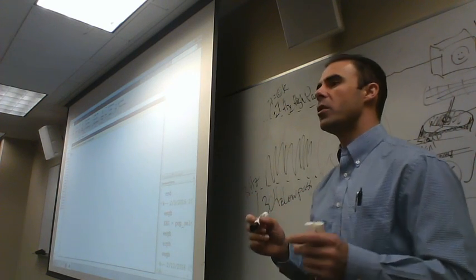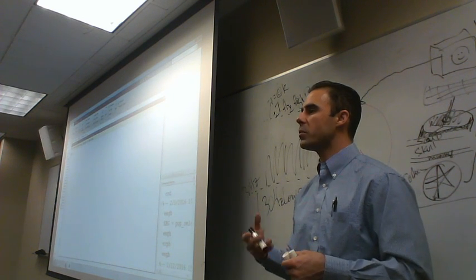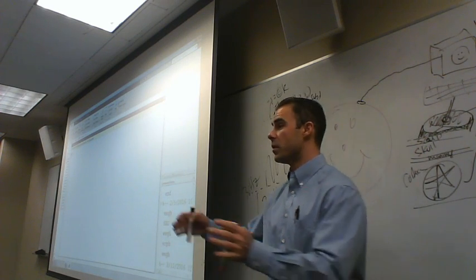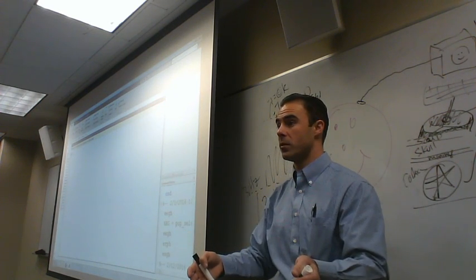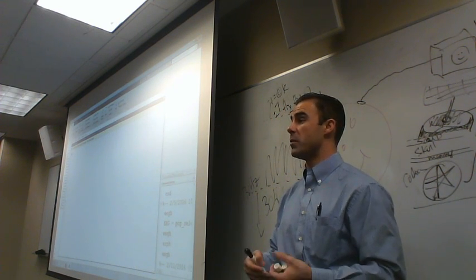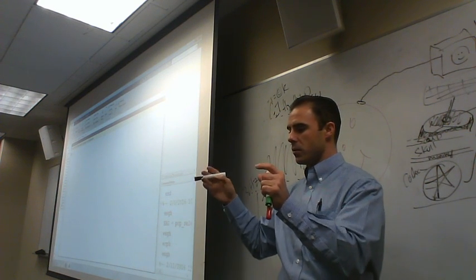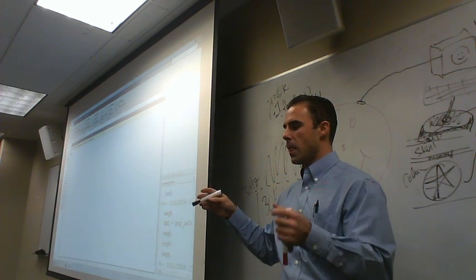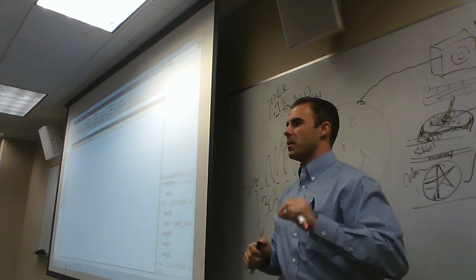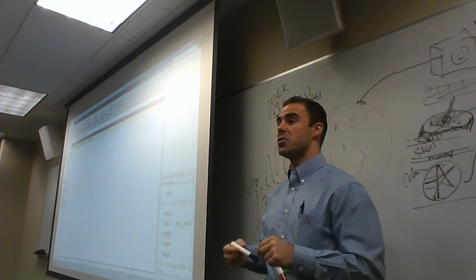And when you filter data, you inevitably change it in some ways. So it requires a really healthy balance and understanding of what you're doing to the data so that you can get rid of the crap but maintain the signal. We call that essentially signal-to-noise ratio. You want to make sure you don't throw the baby out with the bathwater. The thing that I want to emphasize about filtering is that it can distort your data, so you want to do it to the minimal amount possible. Now sometimes the distortion is good. You want to get rid of the crap. Other times the distortion is just negligible.